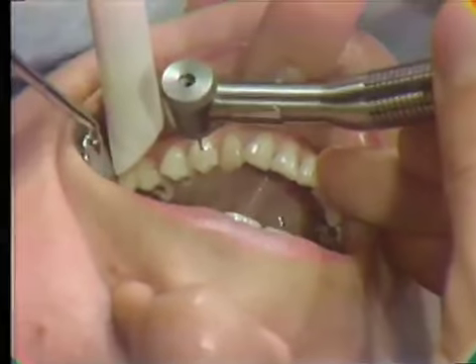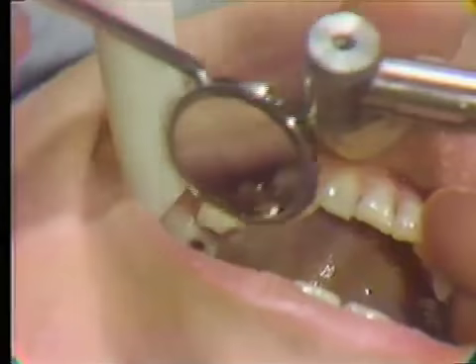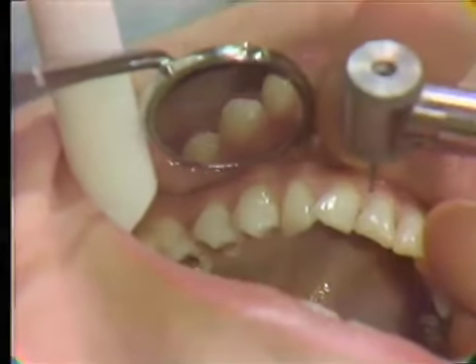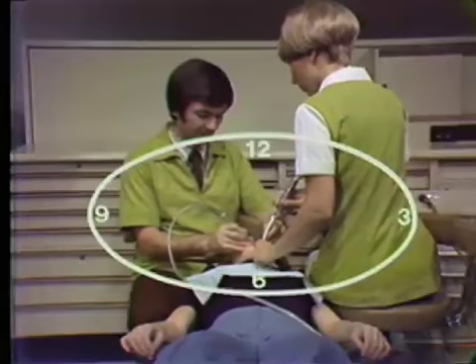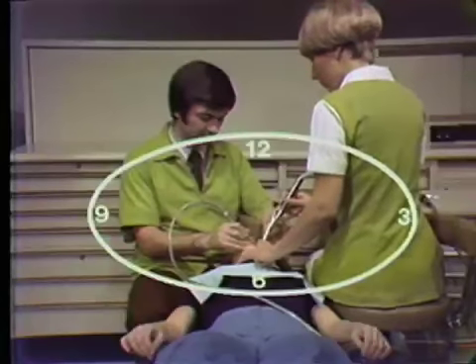Direct vision is used while operating the handpiece using a buccal approach. However, close inspection of the detail of the preparation can be done using indirect vision as the preparation sequence progresses. The operator can work comfortably from the 11 o'clock position with the patient supine. The patient's head is turned toward the operator as needed to improve visibility.